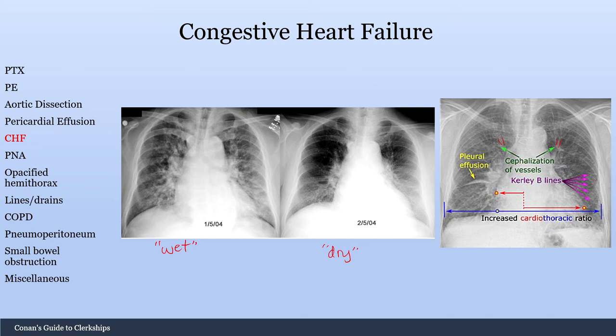Kerley B lines are another CHF finding — small lines seen at the periphery. And cardiomegaly with an increased cardiothoracic ratio of greater than 50% is also a sign of CHF.